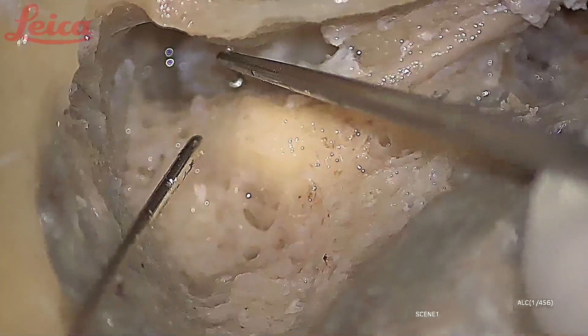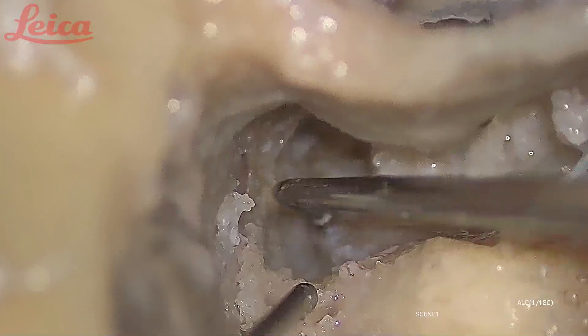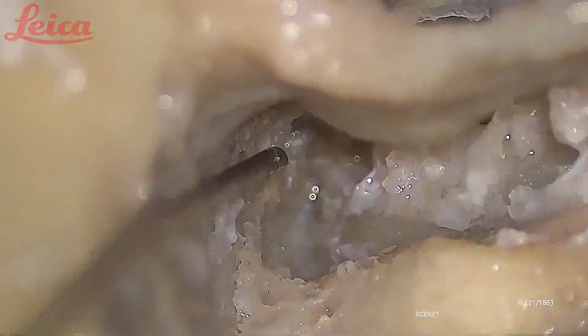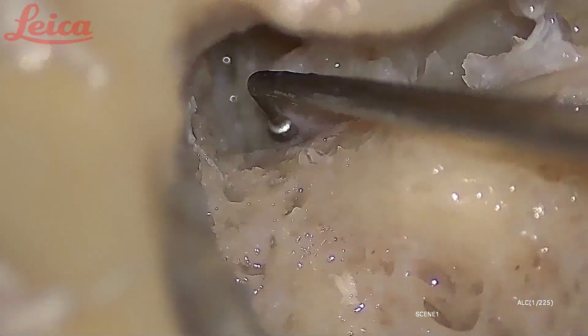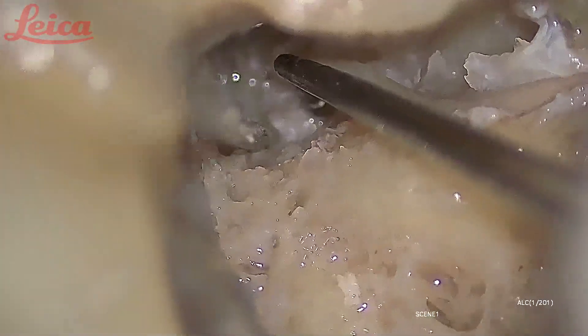This is the area of the second genu. This is the horizontal segment. This is the sheath which I incised, stuck here. This is the GSPN. This is the first genu where the nerve is taking a turn. When I lift the nerve, you can see the beginning of the labyrinthine segment. I can curate out the bone a little bit more but it is not needed right now — if you keep curetting, you will reach up to the meatal foramen opening.